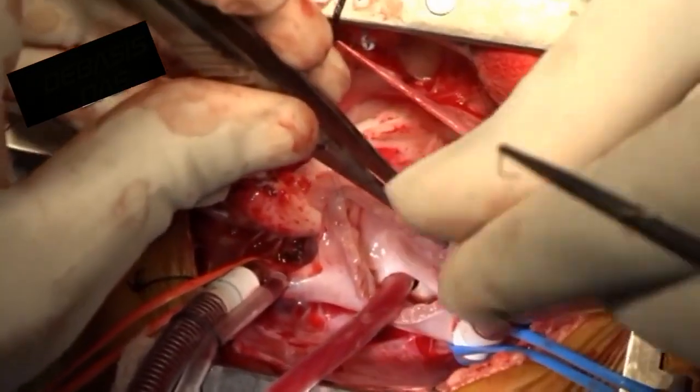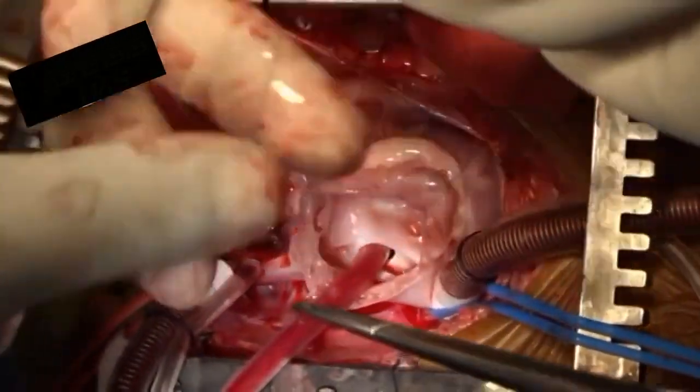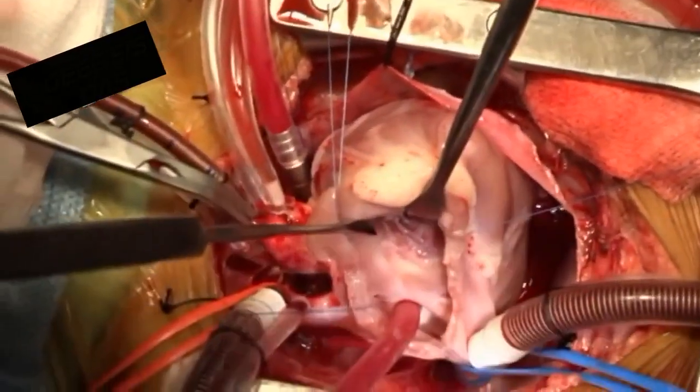Stay sutures are then placed on the right atrium. It is important to use stay sutures in infant tetralogy repair to reduce the retraction to expose the structures. We can see there is a large subaortic VSD.